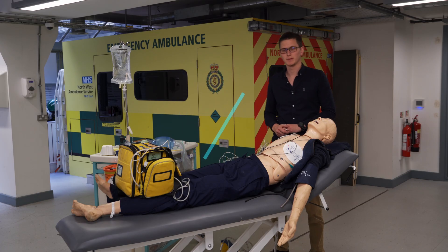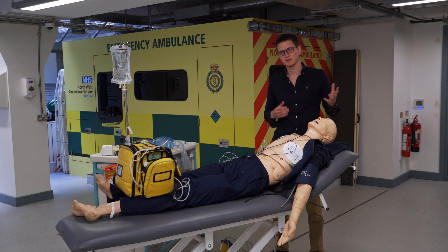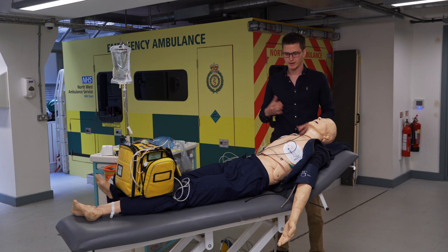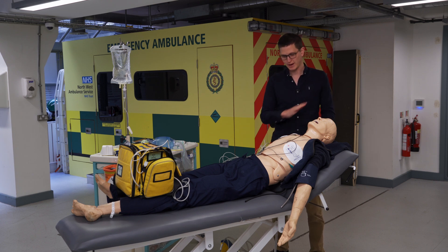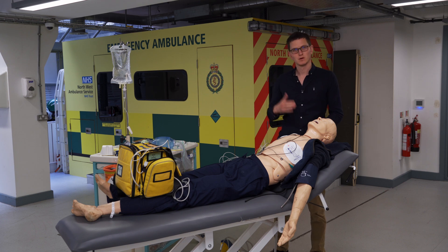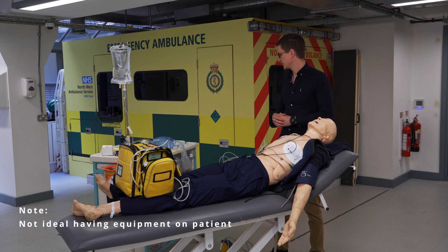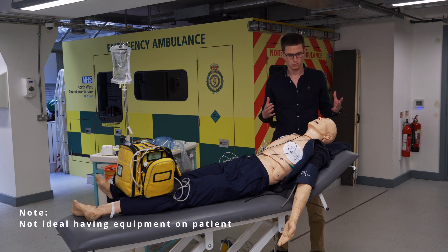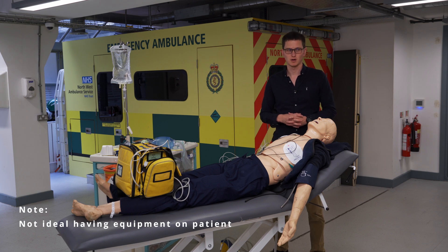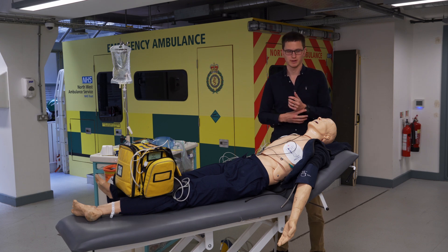Good day. Today we're going to be doing a lesson on RSI, so that's rapid sequence intubation. I'm going to be talking through each and every step. I've already kind of set them up like I would like to. We'll probably make some adjustments in a moment. However, this is kind of what we're wanting. So let's just start at the top — how do we RSI? Why do we RSI? All that sort of thing.